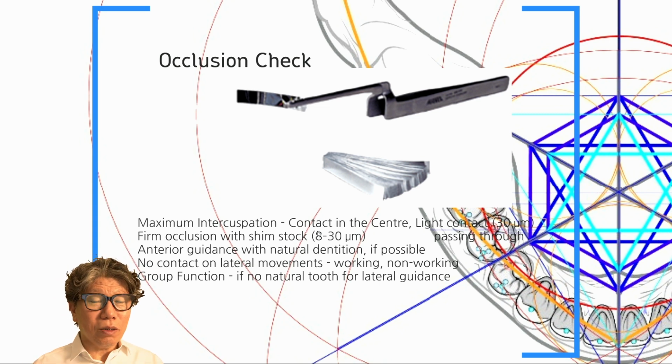Because various situations exist, the only way is to take an impression of the occlusion paper for strategic and qualitative analysis, while also observing the patient's response. We cannot claim that there is an absolute correct answer. It also differs when the patient bites lightly compared to when he bites firmly. It seems that making it as similar as possible to natural teeth makes patients feel more comfortable.